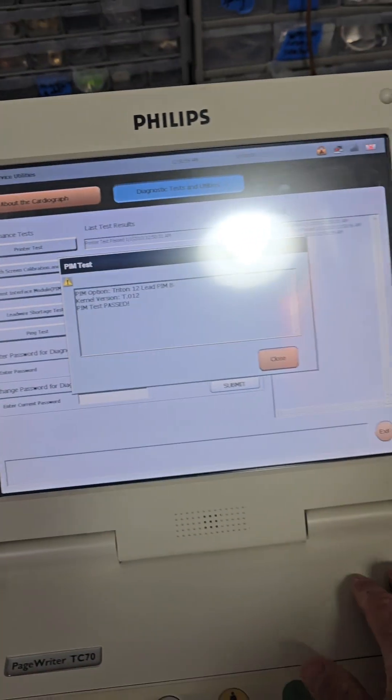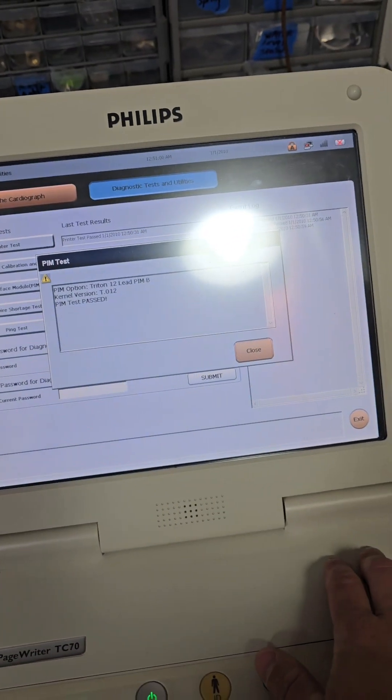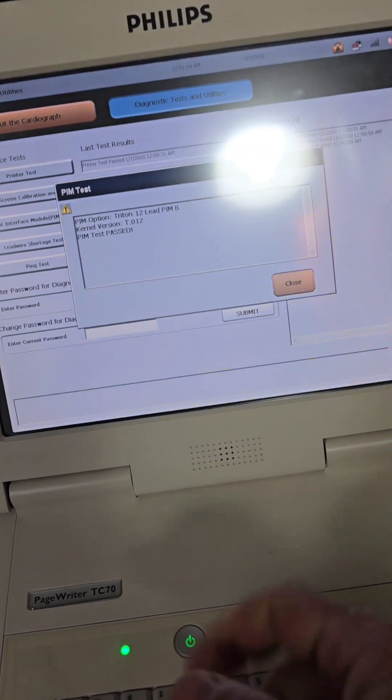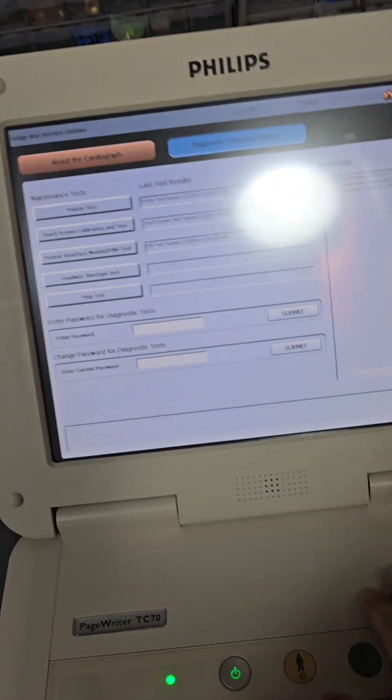PIM. We're hooked up to a SIM. So, our PIM passes.